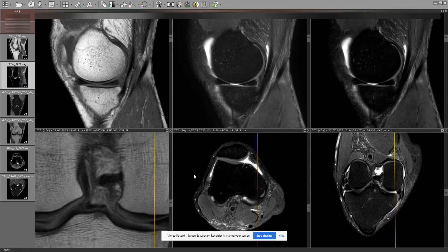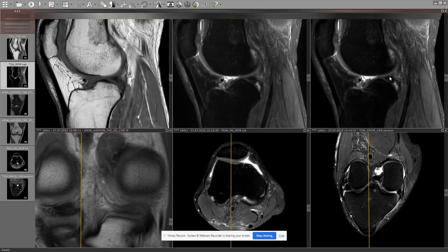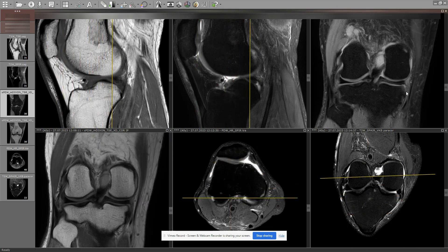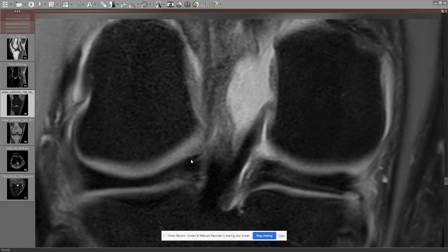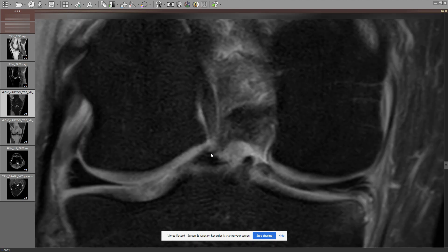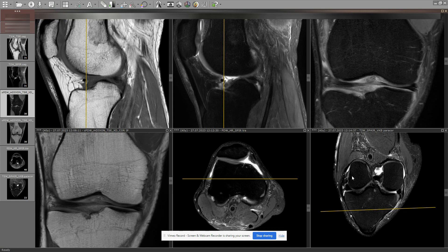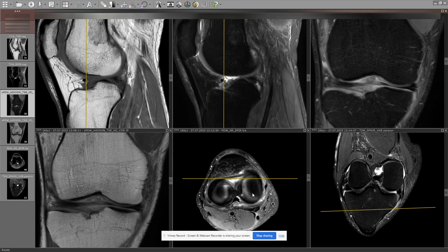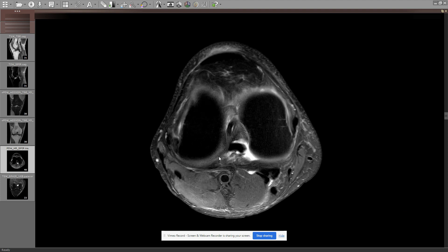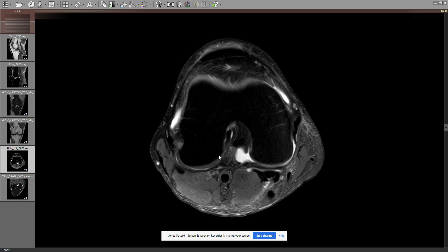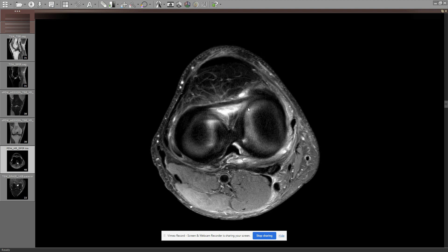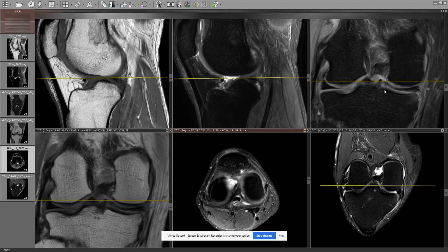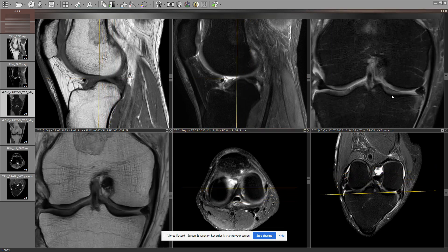Then the cartilage — we can check the cartilage. There are no cartilage defects. Something I can see now, which I didn't see initially, is an oblique meniscomeniscal ligament, potentially. You can see something from the posterior root of the lateral meniscus crossing all the way over into the anterior root. You might actually see this on the axial. This was also tipping me off a little bit regarding the ACL, but I would go with an oblique meniscomeniscal ligament. This is not clinically so prevalent, so I'm not unhappy about that.